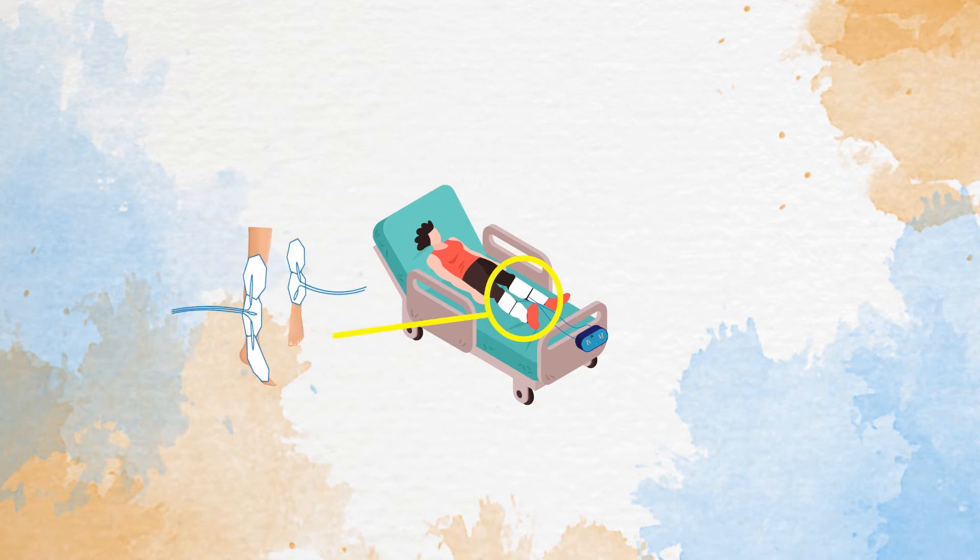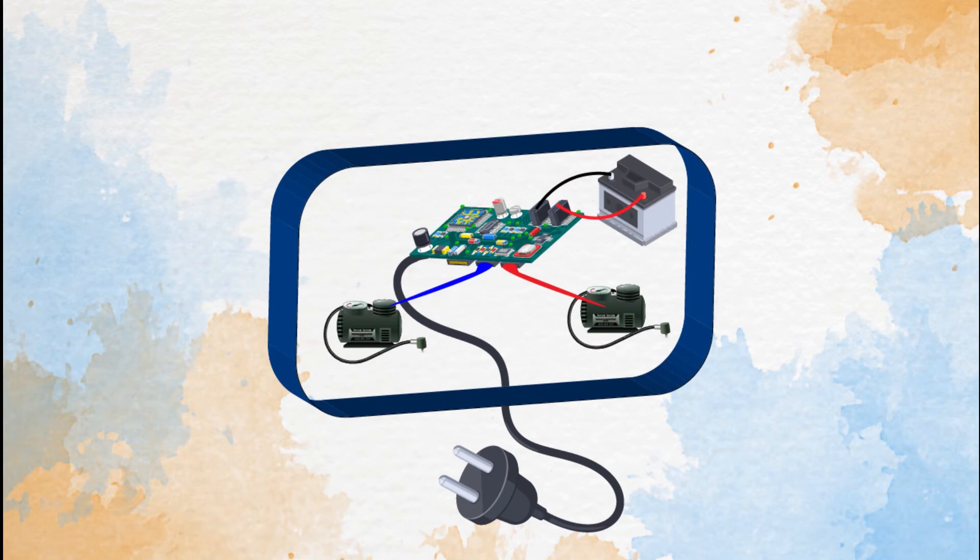There are a couple of very common types of sleeves. The two most common fit around the calf and the ankle, or just around the calf. Looking inside the device, we can see that there are essentially two pumps to inflate the sleeves on the patient's calf, along with a controller board for the pumps and controlling the incoming power, either from AC or from battery.